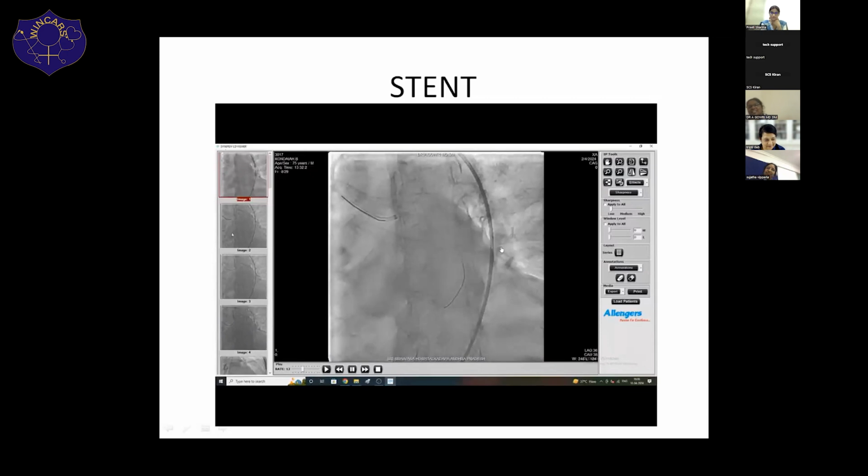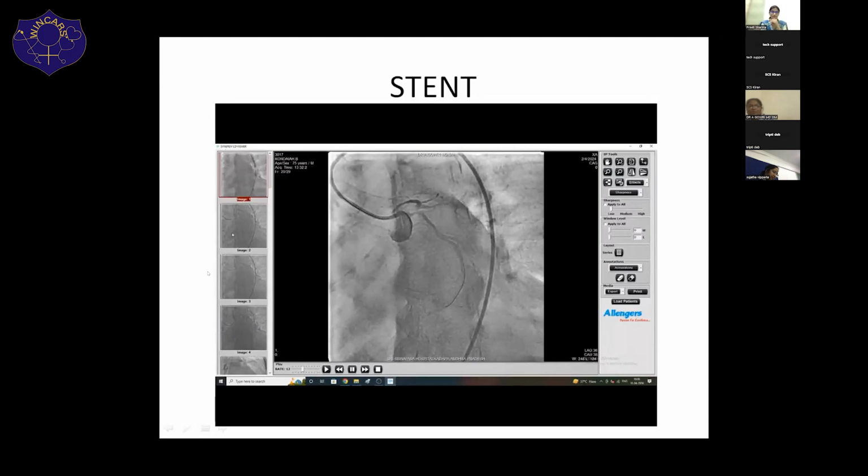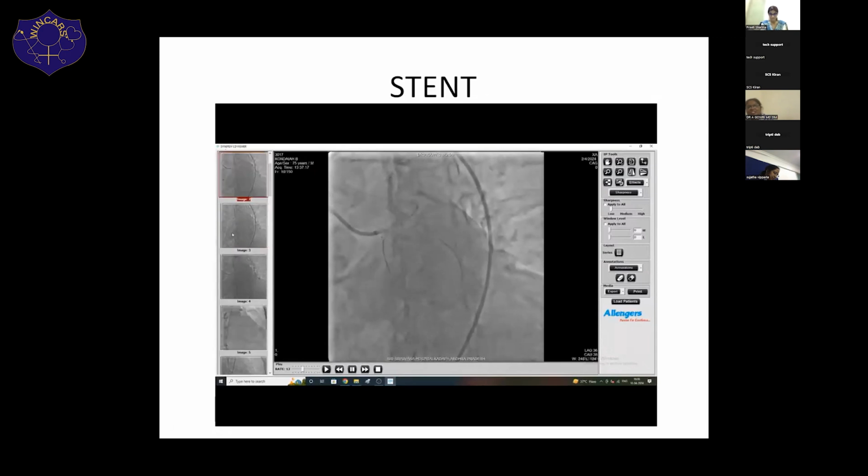So even for me, I had to take up this case because I did not have any other alternative, because the surgeon was saying it is a high risk case. Attenders were not willing to take the risk. So I told them that I will take the decision only after doing the IVUS, because I can find the lesion characteristics and go ahead only after IVUS. I told them IVUS here is diagnostic. I'm not going to take the case before doing the IVUS. So they agreed to that.